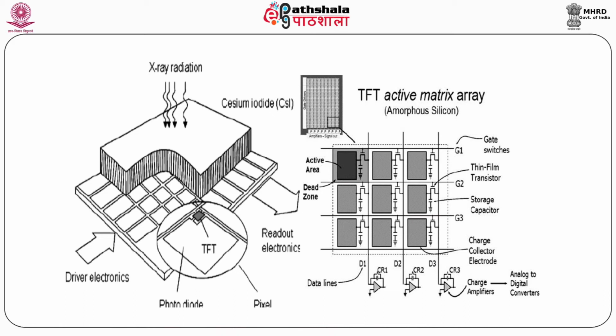The capacitor acts as a storage of charges. The capacitor starts to store the charges, and the charges are read out by using the drain circuit, as I told you earlier. This type of indirect digital detector is very popular nowadays, and most radiology departments use indirect digital detectors.